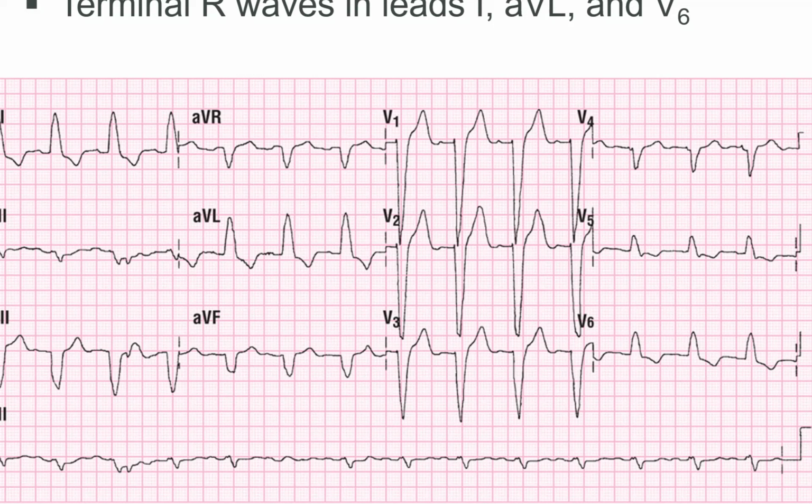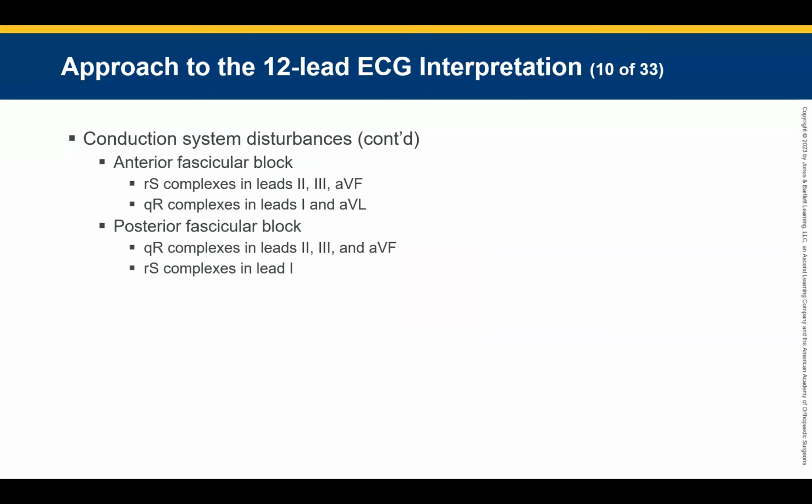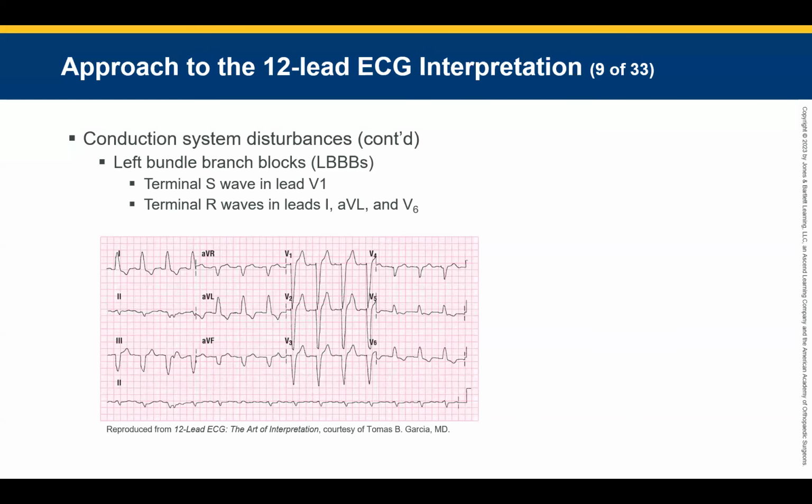Well, no, not necessarily. However, if your patient's having signs and symptoms of a heart attack, and has a bundle branch block they don't know anything about, we should probably be concerned because there's a blockage of the electrical system. Where is it at? It's in the ventricles, down by the bundle branches. Yep. And so now we have this issue, and we could be having a heart attack, but we're probably not.